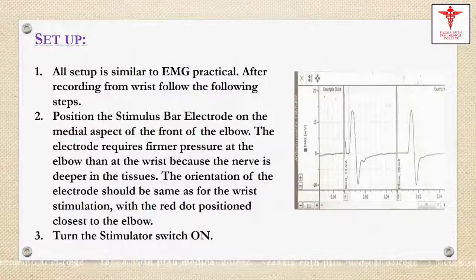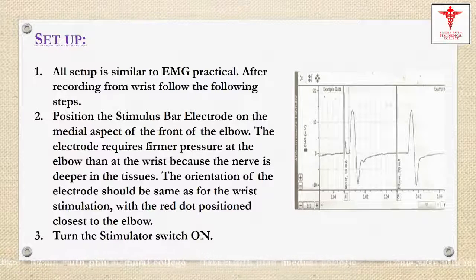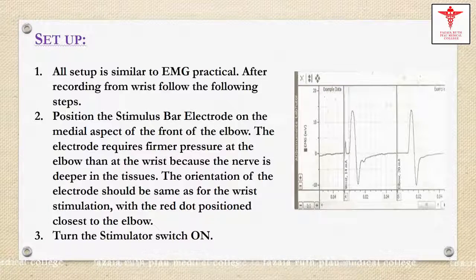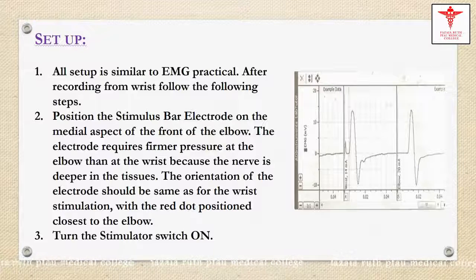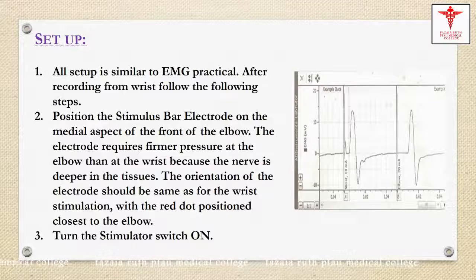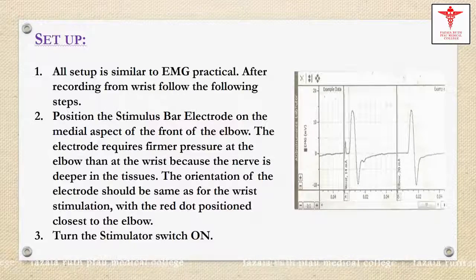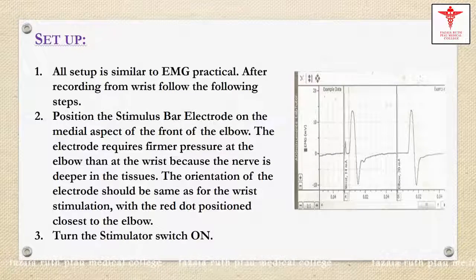All setup is similar to the EMG practical. After recording from the wrist, follow the following steps. Position the stimulus bar electrode on the medial aspect of the front of the elbow. The electrode requires firmer pressure at the elbow than at the wrist because the nerve is deeper in the tissues. The orientation of the electrode should be the same as for the wrist stimulation, with the red dot positioned closest to the elbow.